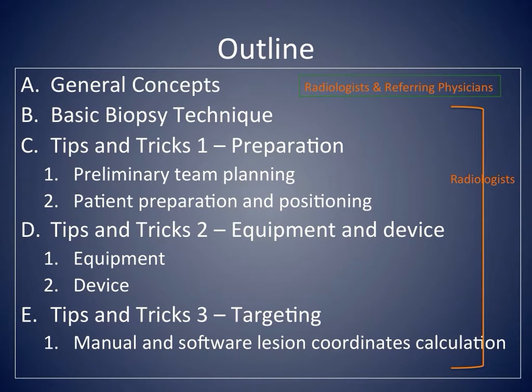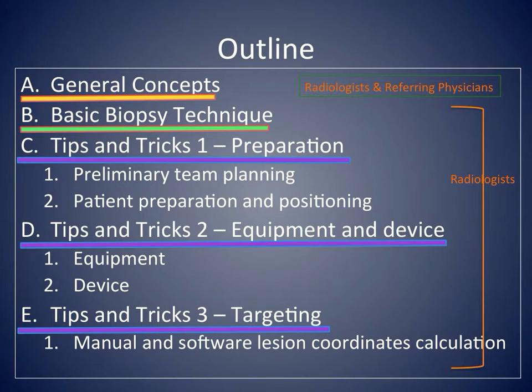We have divided the topic in 5 sections for easy reference. The first section, General Concepts, is a general overview that can be of interest to radiologists and physicians referring the patient for the procedure. The remaining 4 sections are for radiologists. The basic biopsy technique is an overview of the entire procedure, and the following 3 sections have technical tips and tricks for radiologists that perform the procedure.